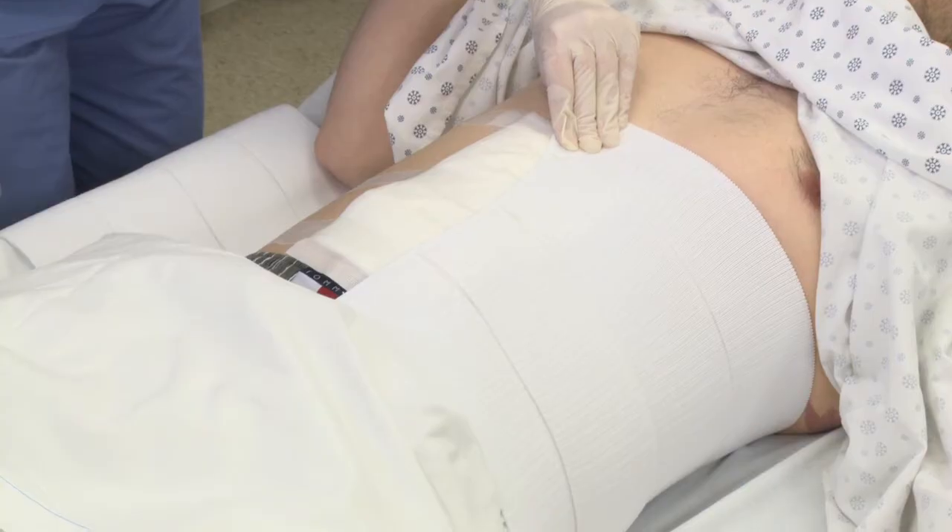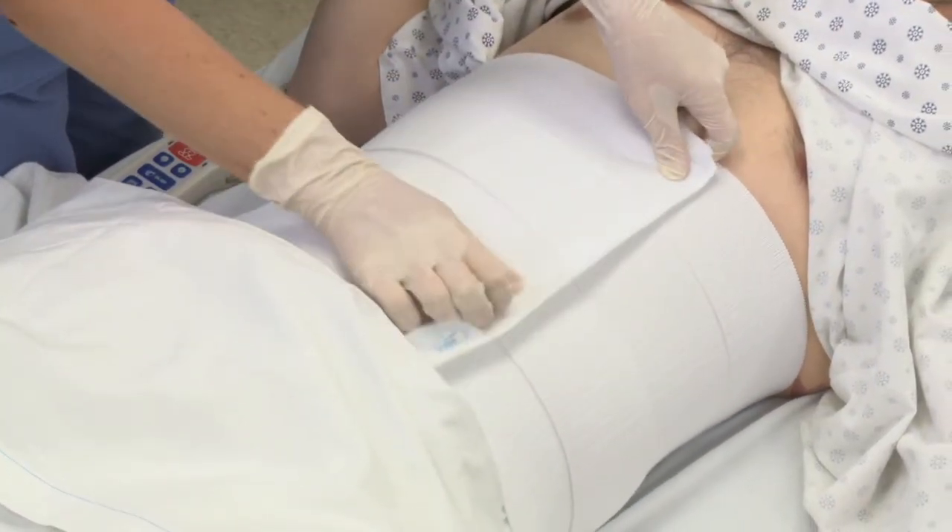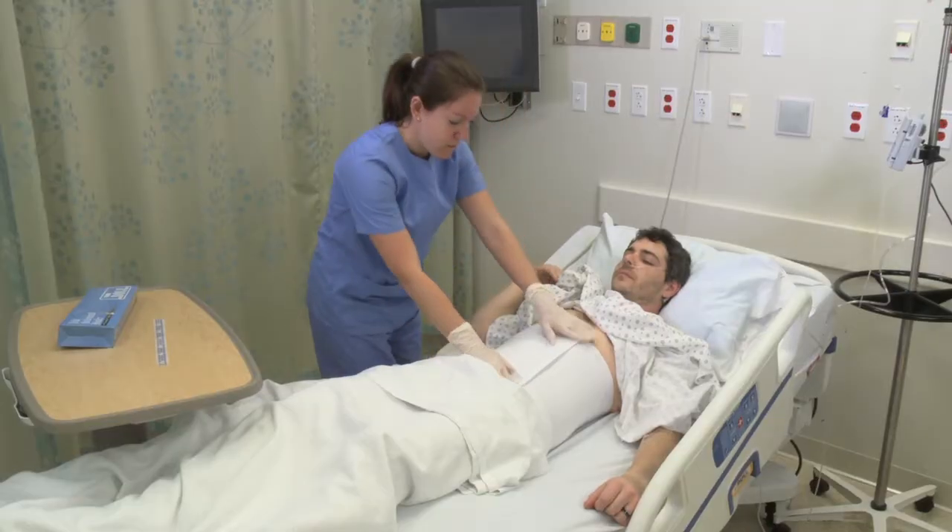With your other hand, grasp the end of the binder in the middle, stretch it upward over the patient's body, and firmly engage the hook surfaces.